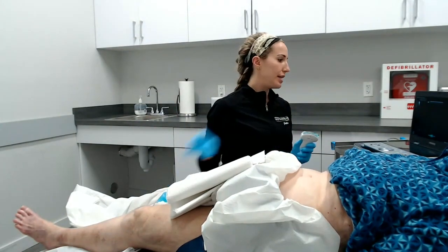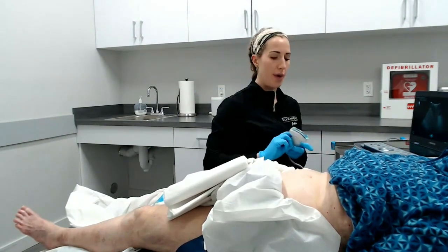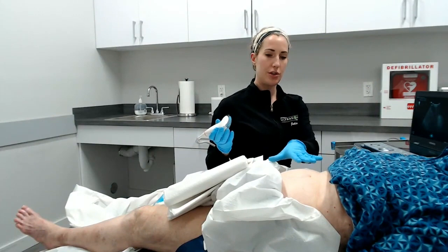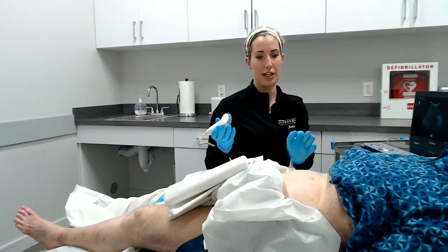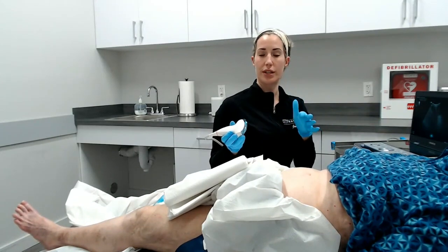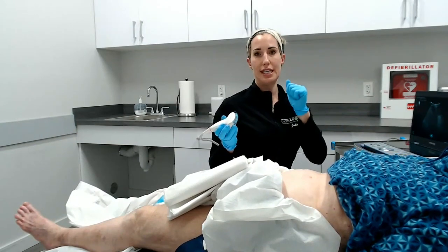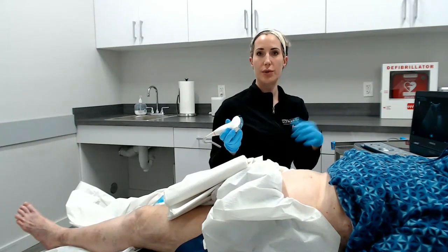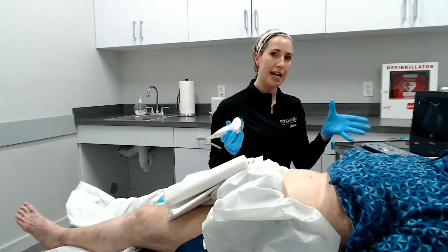So automatically what I do is before I start looking at the stent, I'm going to assess the stent. It's going to be a limited protocol, by the way. So again, we're not spending an hour here. We're looking, one, especially since she only has a vein stent in her left side, we want to make sure that the proximal stent isn't jailing off the right common iliac vein. So automatically I'm going to go up and just make sure that there's flow in the common iliac vein on the right side. And then I'm going to assess the stent in short axis view to see the adherence of the stent to the vein wall. And then in longitudinal view, I would do diameter measurements and flow velocities, prox, mid, distal, pre and post stent.